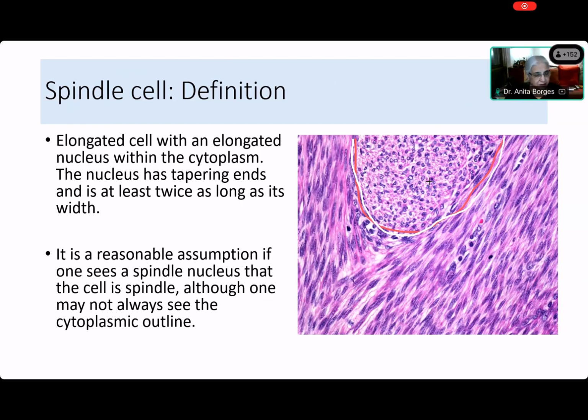Okay. Diksha? Are you there, Diksha? Diksha has muted herself. No, I muted Diksha and Dipali just to check. I'm so sorry. Diksha, I'm unmuting you. Are these spindle cells, Diksha? Ma'am, can be spindle, maybe transverse section. Okay. Elsa, are they spindle cells? Yes, ma'am. They can be the cut section. All right. And Dipali? Yes, ma'am.